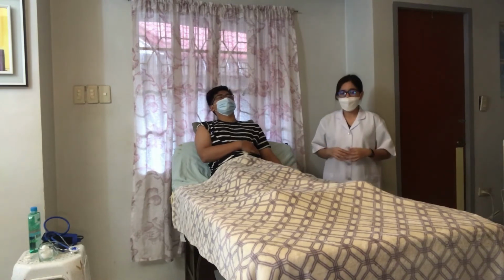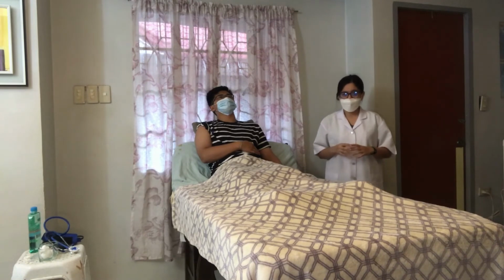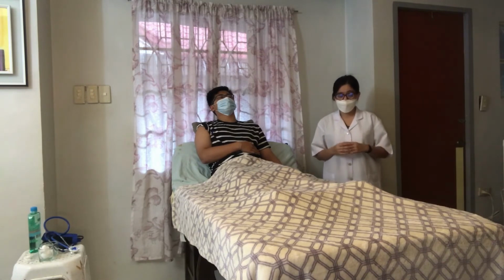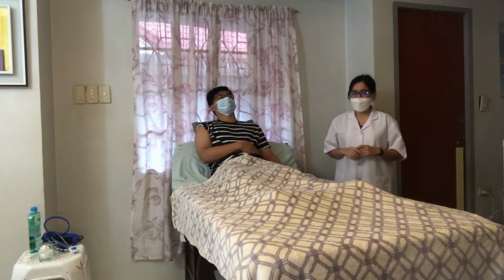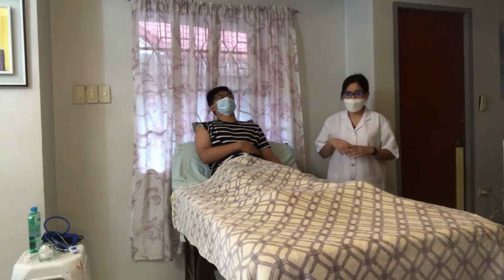Now after that, when any abnormal breathing pattern is noted, we must use the next 60 seconds to carefully observe the characteristics of the client's respirations. And if there are any abnormal findings, we must refer them to the physician, or if there are any complaints from the client such as difficulty of breathing. So now we are going to proceed to taking the blood pressure of the patient.